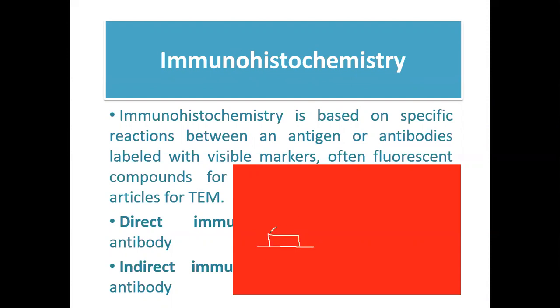Ito yung antigen ulit. Sorry, uulitin ko lang kasi para makita. Ayan. O, di ba? Yan na yung antibody natin. Tapos ito yung isang antibody. So, ito na yung secondary antibody labeled. Yung isa, pwedeng may kumabit dito. Okay? Pwede namang may kumabit din dito, guys. O, labeled siya. Okay? So, pwede din namang meron dito, kakabit na antibody.